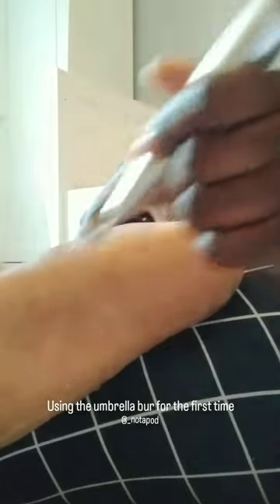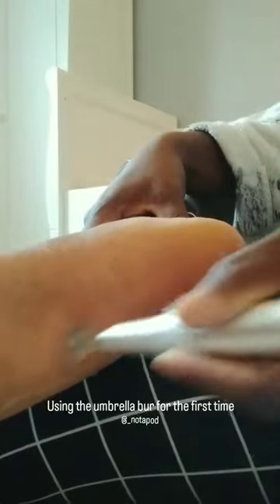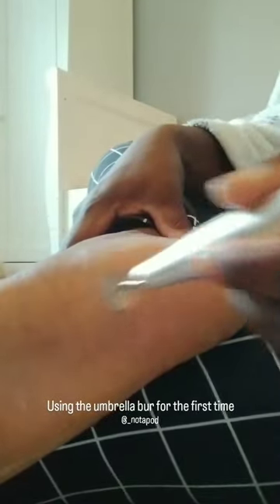What I've done is sprayed my foot with some Clinicept. This is just to reduce the amount of dust that can be created and also to reduce down any heat, so if it gets hot I won't feel it as much. I didn't feel any heat whatsoever — even before I sprayed my foot. I feel like it depends on how you use it, and I feel like the faster the better.